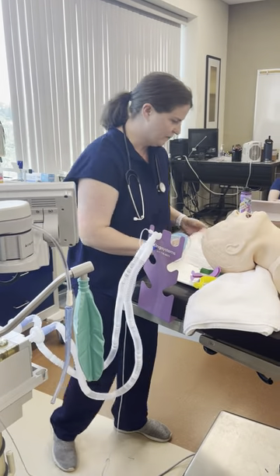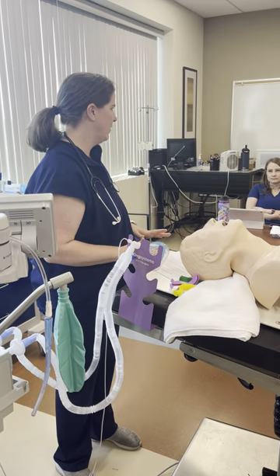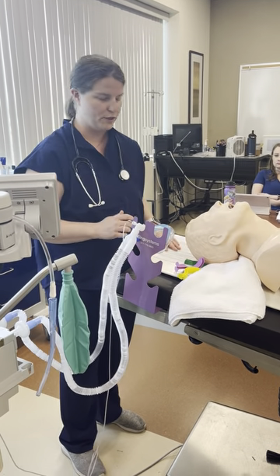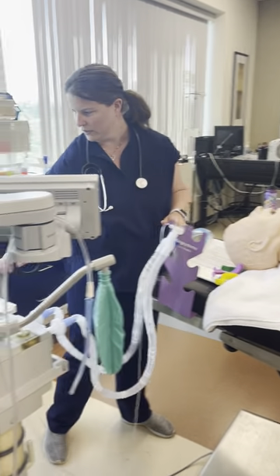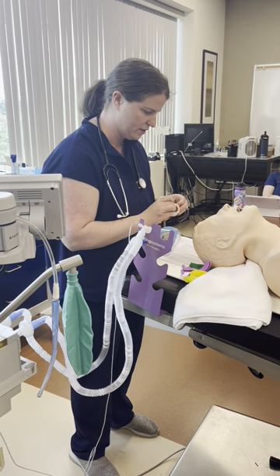We're not going to do the whole SAMTID induction and intubation right now. I'm just going to show you the steps of ventilation and intubation. We'll say we've already done our induction process and the patient's eyes are taped.